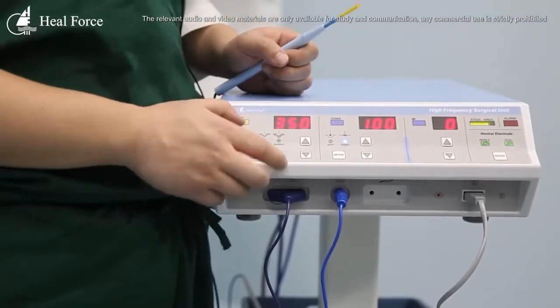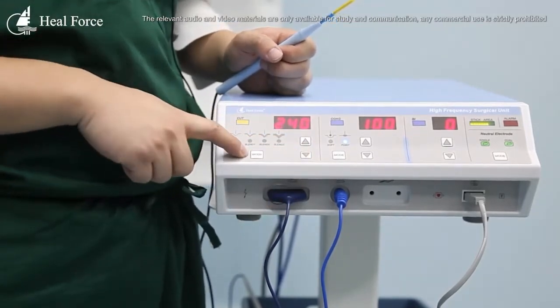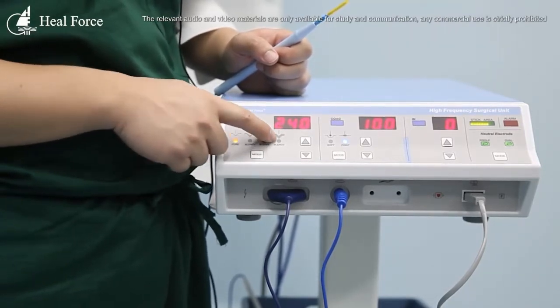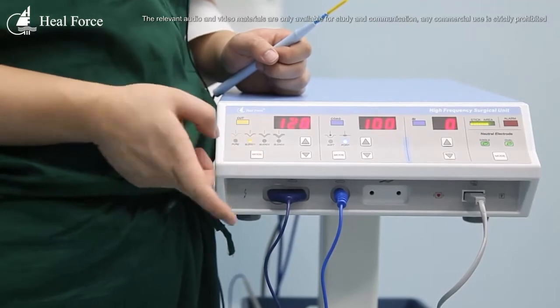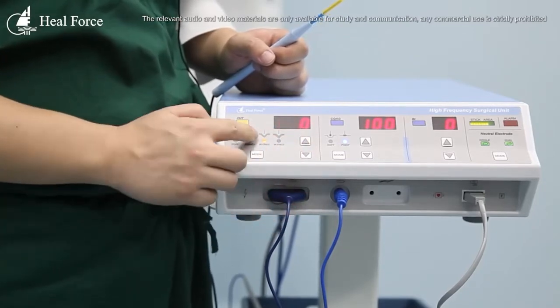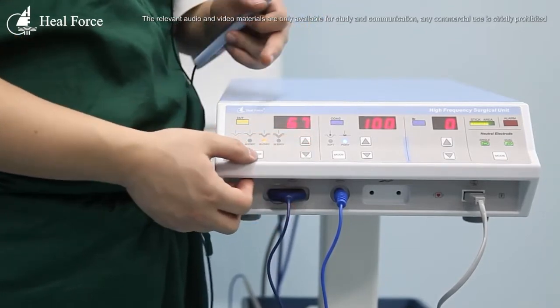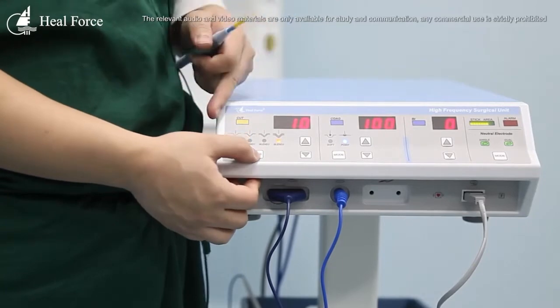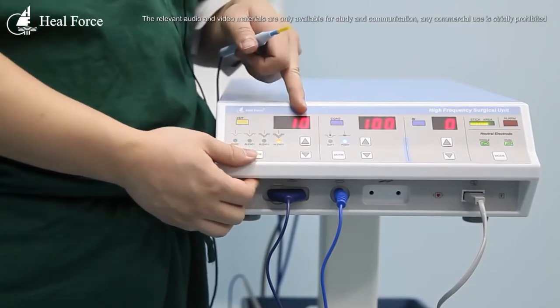Now let's look at how to adjust the output. There are different buttons to control the output, and this button controls the mode. We have pure cut, blend one, blend two, and blend three. These are for different cutting applications on the patient's body. Each blend mode has its own output settings stored in the machine — you only need to switch the button, and all the settings are remembered.